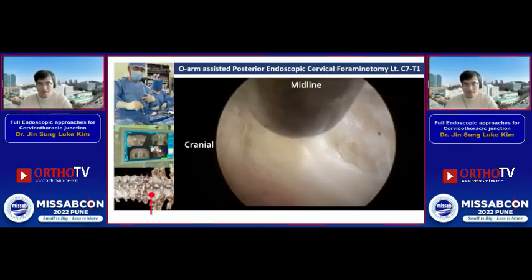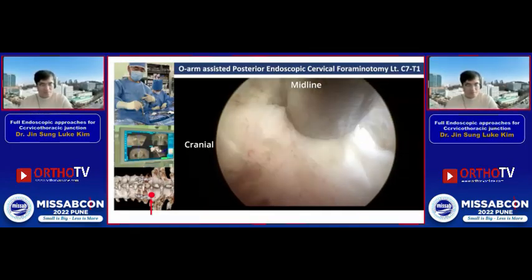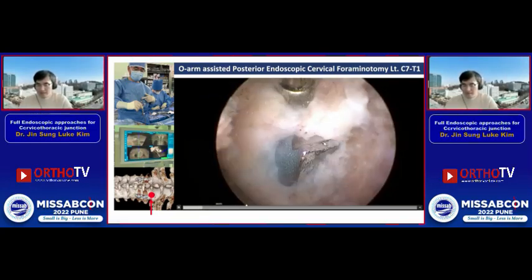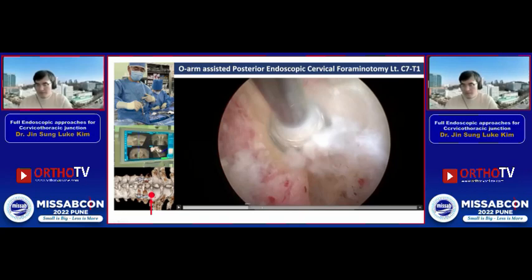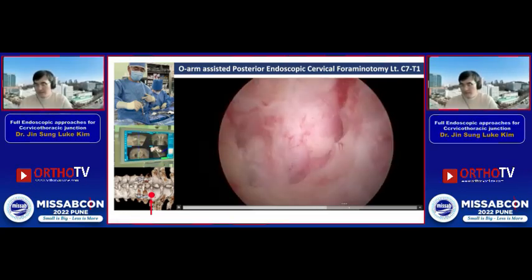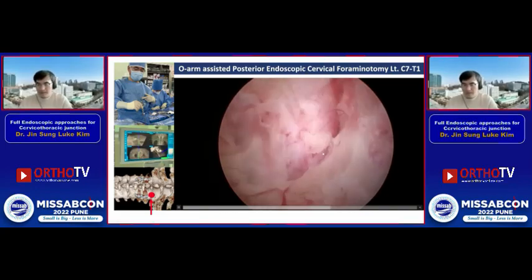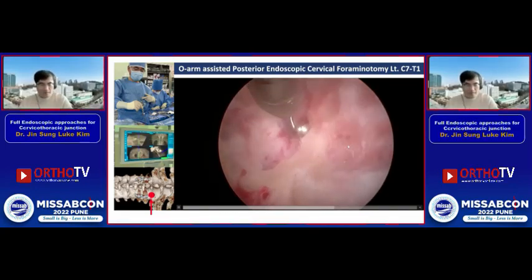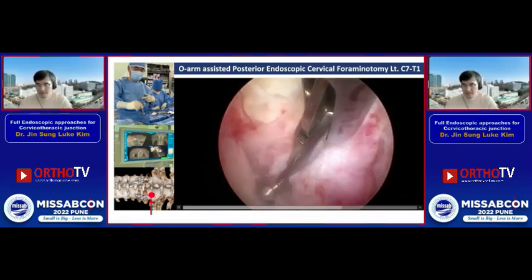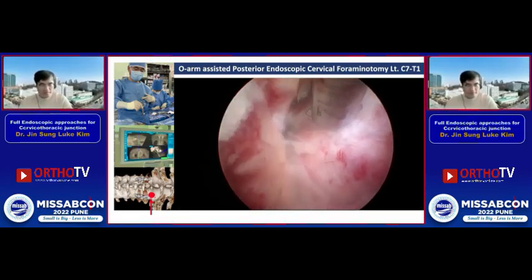This is the surgical planning and the operation view. Because of the little time constraint, I'm going to move to the final status. You can see the C8 nerve well, and palpate the caudal pedicle and cranial pedicle as well.